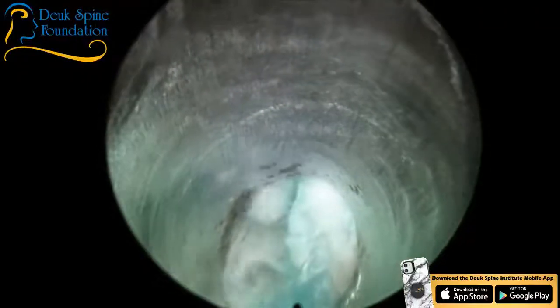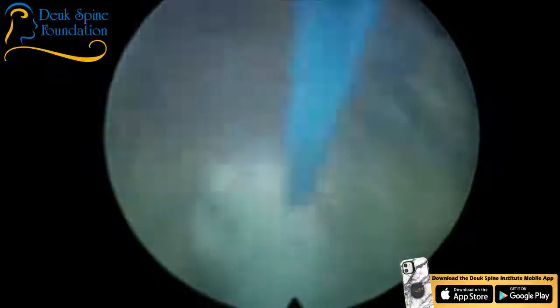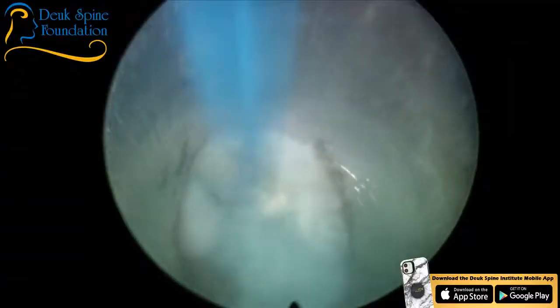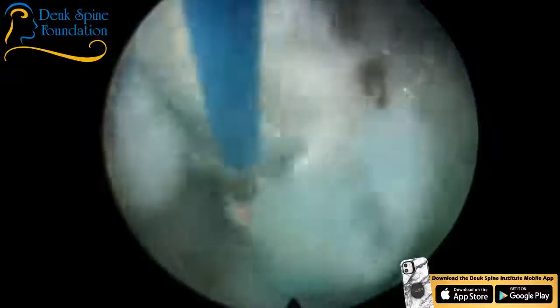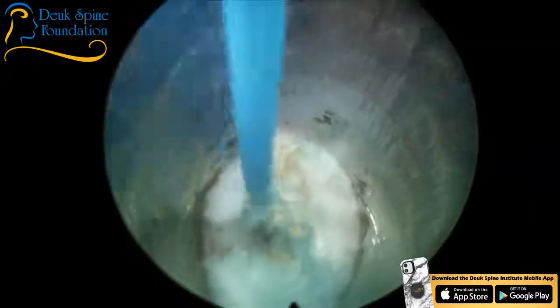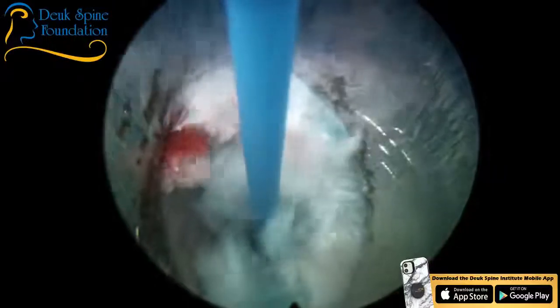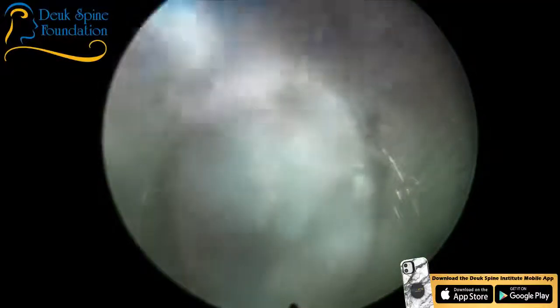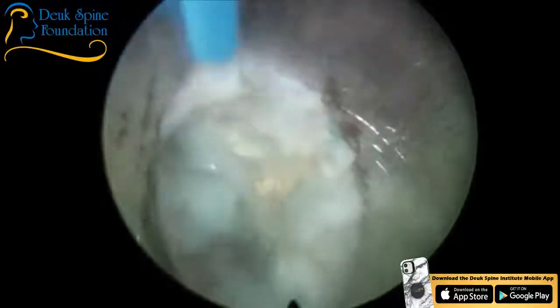That's not something he described. There's the tear. That's what I'm after right now. That may be a part of herniation too right there. All right. That's a piece of herniation. I just detached some of it. This is all scarred up herniation right here.